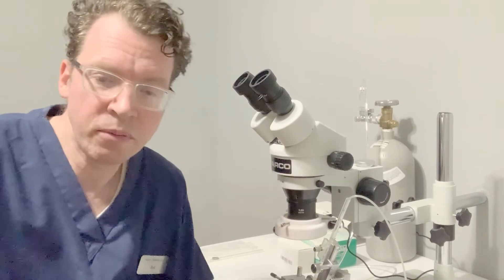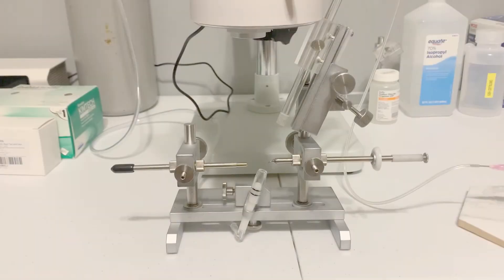To begin, let's take a look at the instrumental insemination apparatus. The instrument itself is made of stainless steel parts and replicates the design of the popular Schley instrument. The instrument is compatible with Schley equipment.